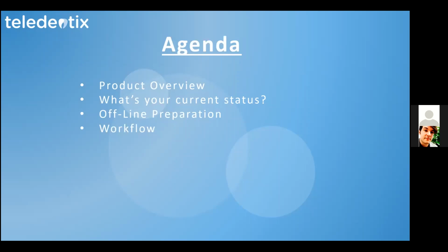We're also going to review what your current status is. Have you ever used Teledentix Capture? If not, how do you go about downloading it? If you have used Teledentix Capture, or maybe you have it installed on your computer right now, what are the steps that you need to take to make sure that you have the latest and greatest? There are some steps here, so definitely pay attention for that part.